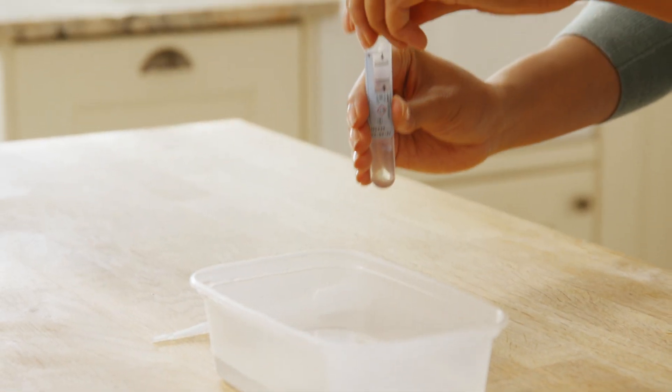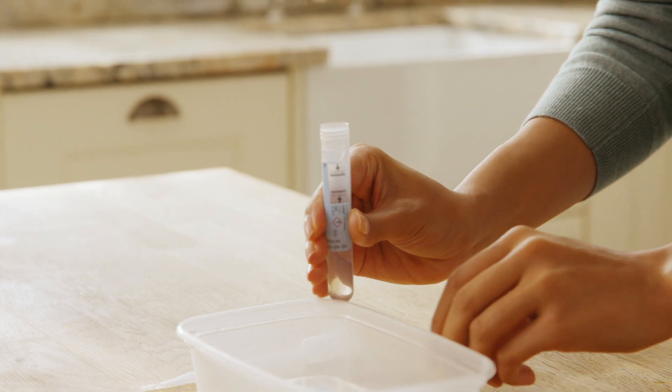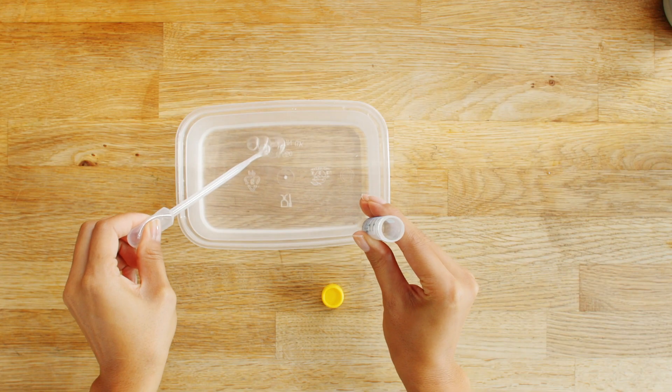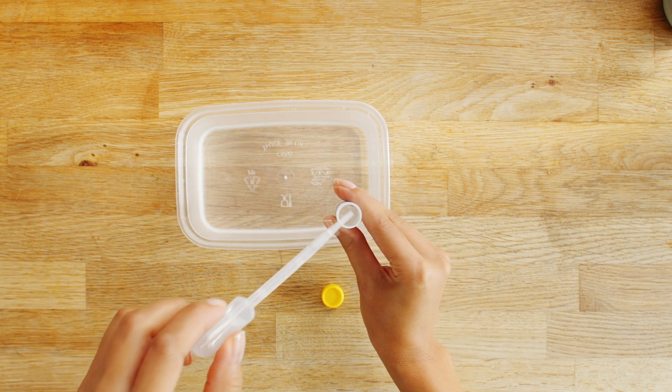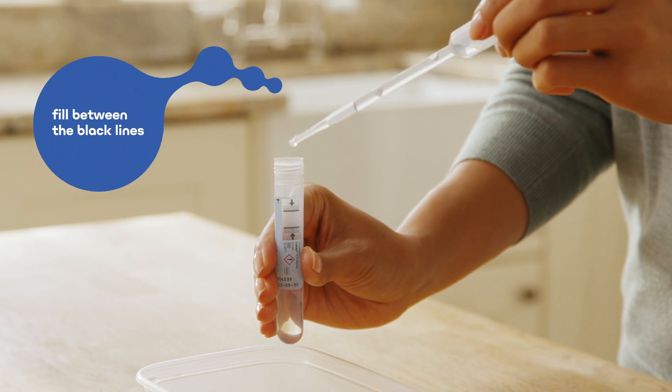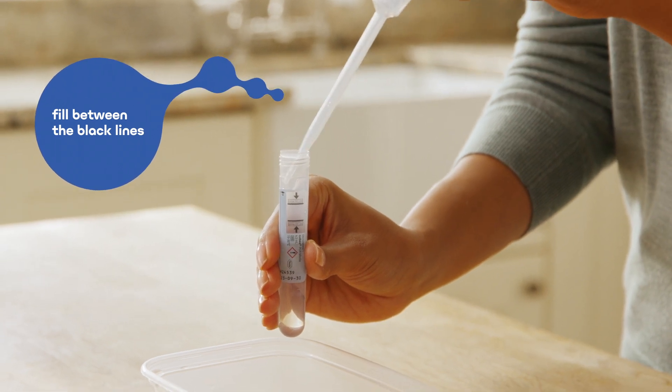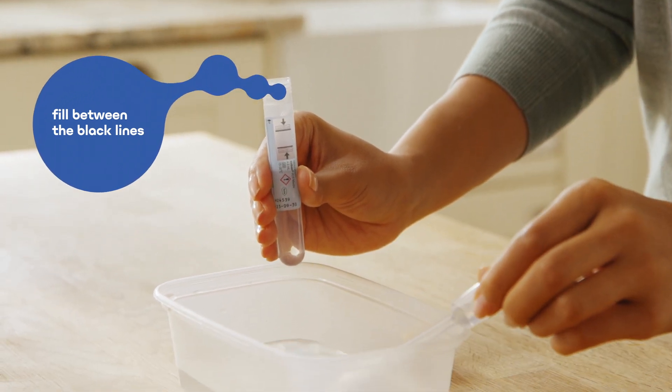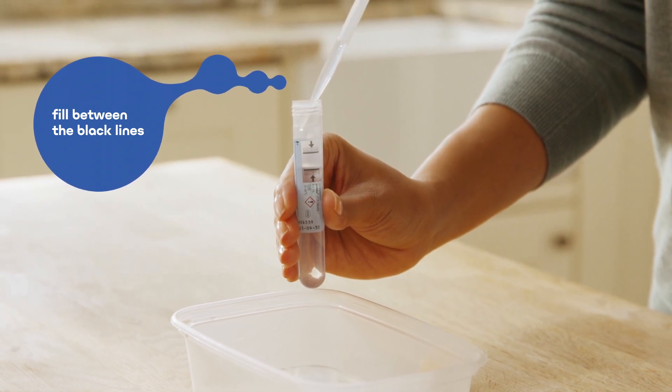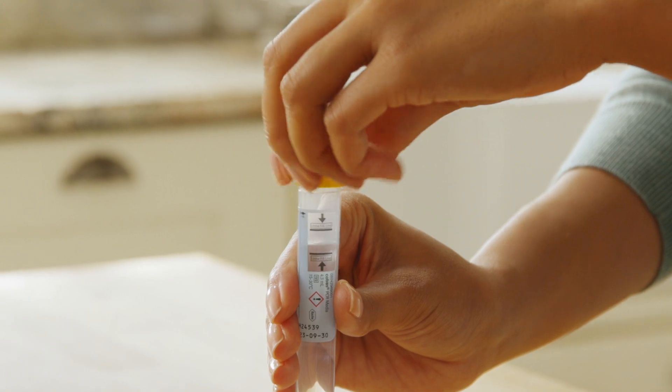Take the urine specimen collection tube with the blue label and remove the lid, taking care not to touch or spill the contents. Once you are ready, take your pipette to your container and gently squeeze the end to draw up the sample. Point the end of your pipette into the specimen transport tube and squeeze the bulb once again to fill the tube until the urine level is between the two black lines. Screw the cap back firmly onto the tube.